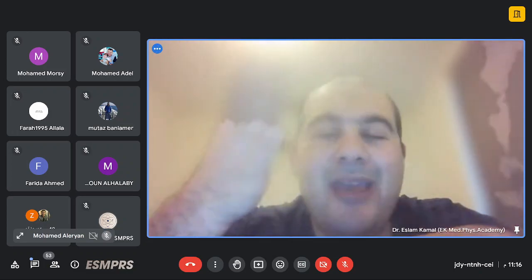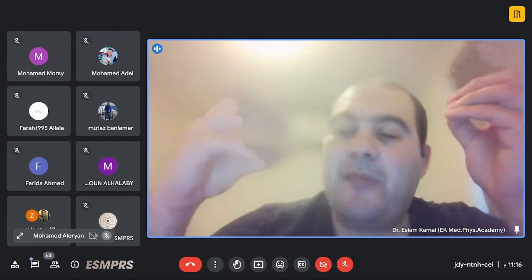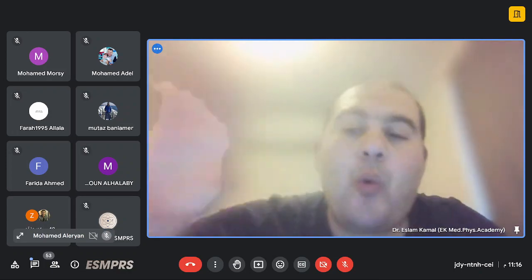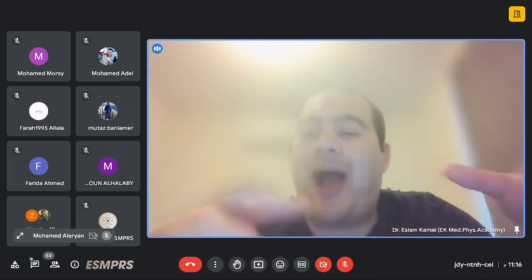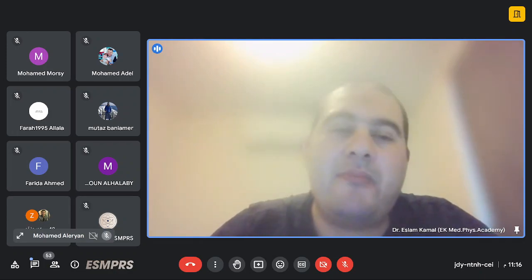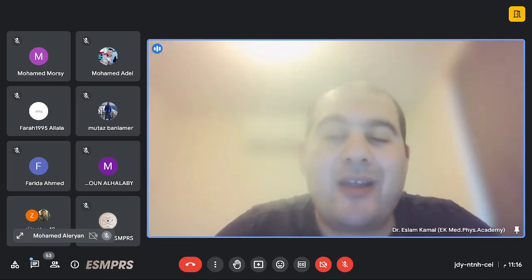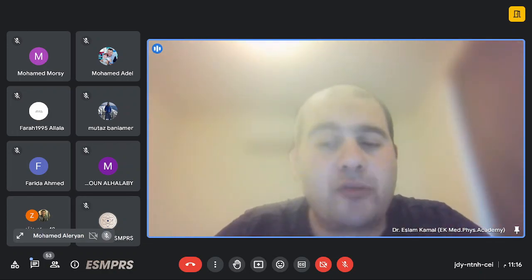تمام. طيب التوقيت اللي انت شغال عليه معتمد في الاساس على انك انت عايز تماكسمايز الديفرنس في التي 1 ولا الديفرنس في التي 2 ولا الديفرنس في البروتون دينستي. ده لما نيجي نتكلم عن السبين ايكو او الفاست سبين ايكو. فبتختار تي ار معينه او تي اي معينه، في التي 1 بتختار شورت تي ار شورت تي اي، في التي 2 بتختار لونج تي ار لونج تي اي، وفي البروتون دينستي بتختار لونج تي ار شورت تي اي.